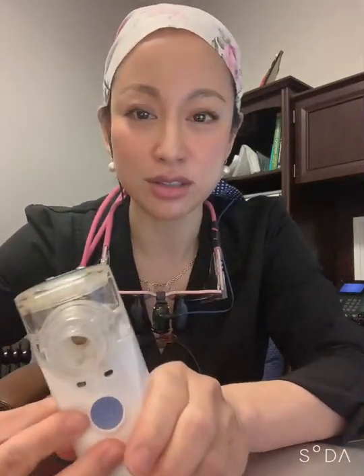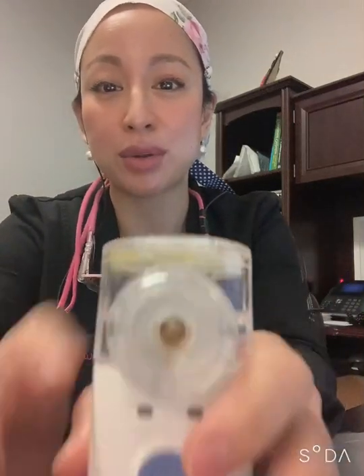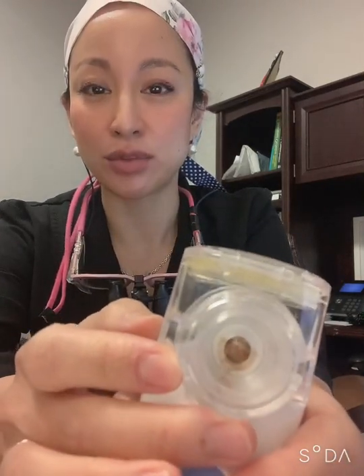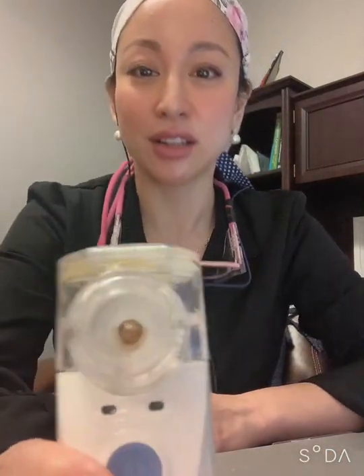I ruined this nebulizer because I wanted to nebulize with iodine as another level of clearance of microbes within my respiratory system. I felt great with it for a while, and it was working great. But then I realized that the iodine itself was leaving a residue on top of the mesh, and I couldn't clean it. And so now the mesh is completely clogged up.